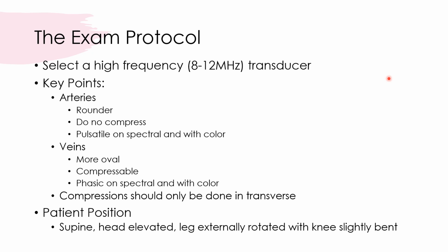clear image of that vein, then it is 100% okay to utilize maybe a curvilinear or a much lower frequency transducer, whatever gets you the penetration you need. But for most people, we like the good visibility that we get with that higher frequency transducer. Some key points to remember while you're scanning.